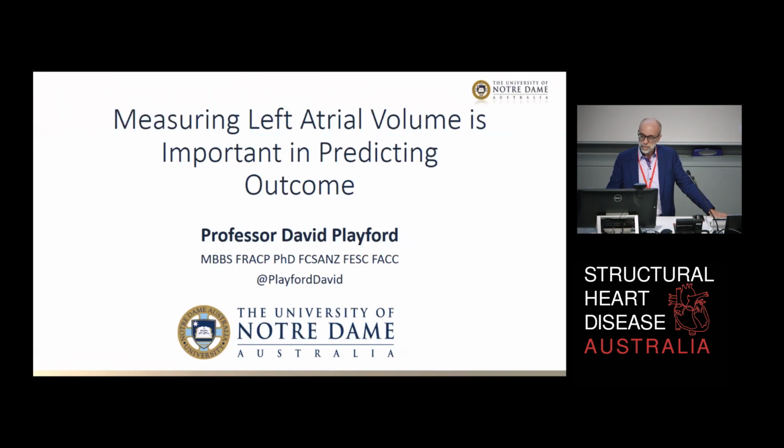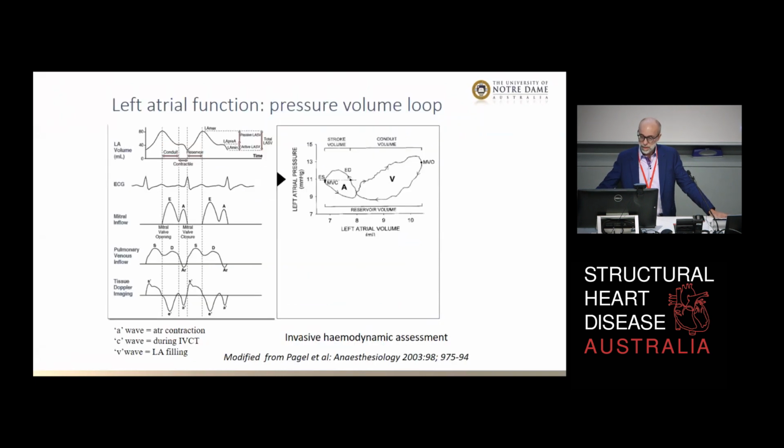So I'm going to go through a little bit about left atrial volume. You recognise this slide, which is exactly the same slide as Lisa put up, in fact, with exactly the same little drawings on it. This is the part that I'm not going to go through, the strain measurement. But what I just wanted to point out is that it's at the maximum left atrial volume where you would normally do this measurement to just get a static volume. So we're not talking about dynamic volume here. Purely from a static point of view, you want to get the biggest volume.